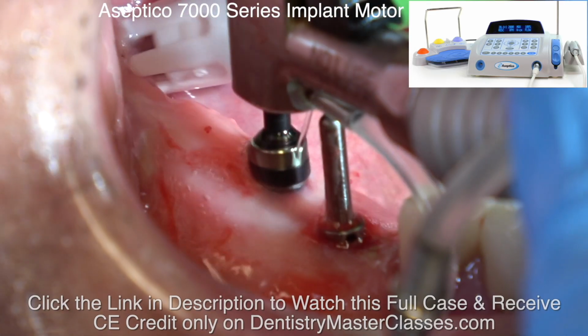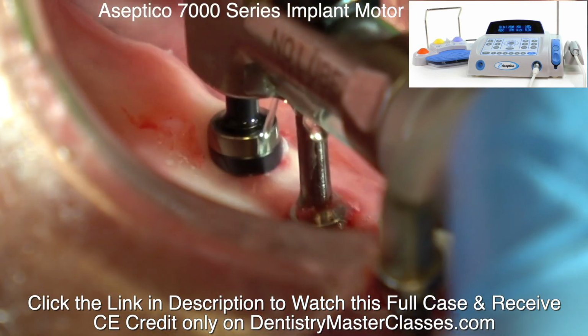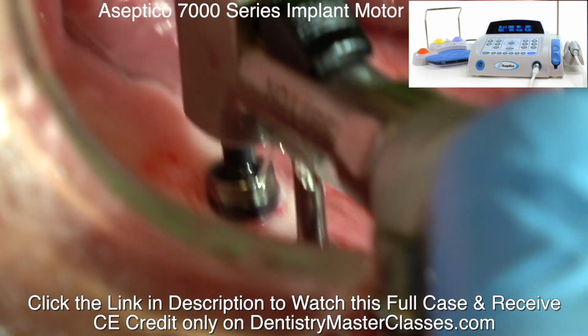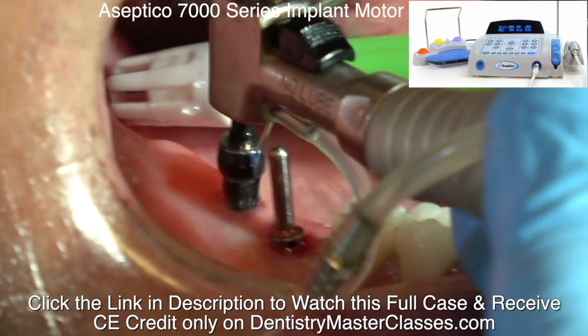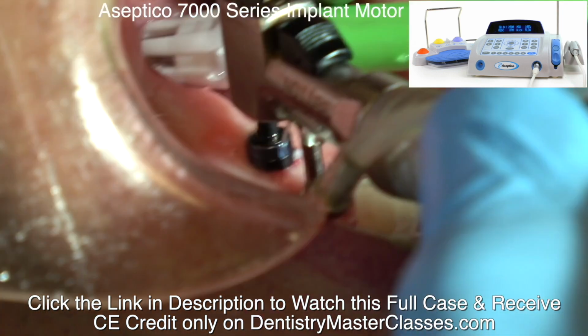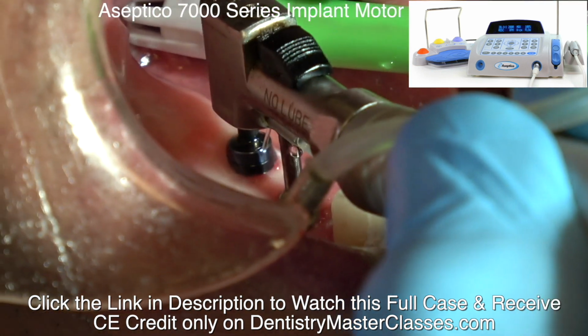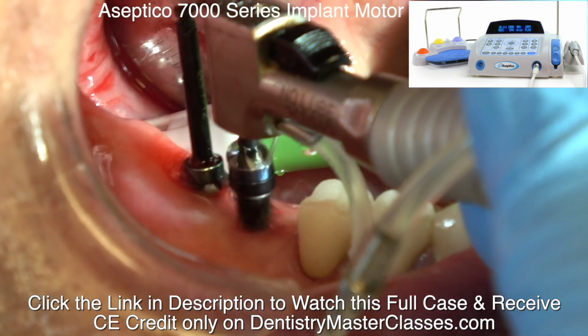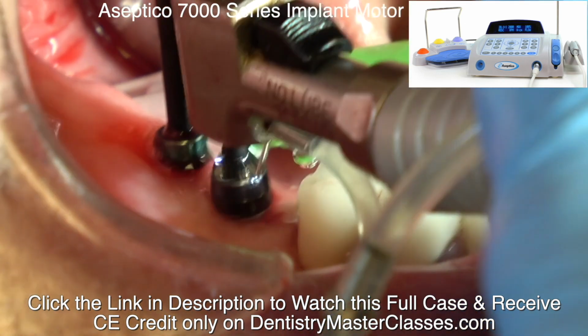I've got the paralleling instrument in here, piece in here, and then I'm drilling behind. So now I'm up to a 4.3 millimeter drill, wide drill. Always keeping the paralleling device in there, or paralleling piece. See, so now I'm just leaving the drill in there so I can see that they're pretty parallel.